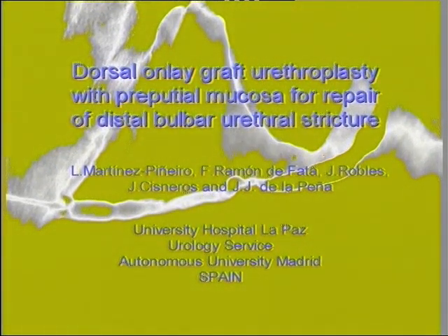In this video we show the surgical technique of dorsal only graft urethroplasty with preputial mucosa for repair of distal bulbar urethral stricture. This 56-year-old man presented with a three to four centimeter long urethral stricture of unknown etiology located in the distal bulbar urethra and proximal penile urethra.